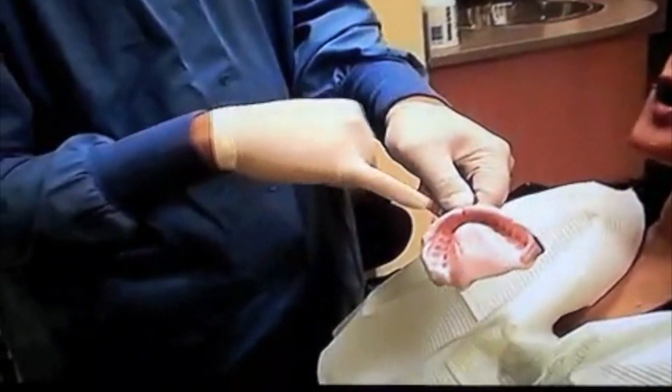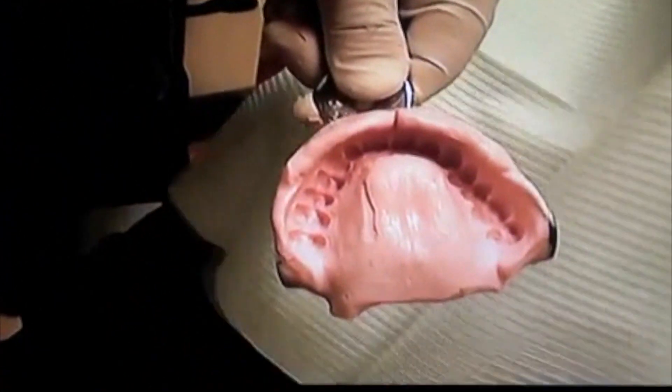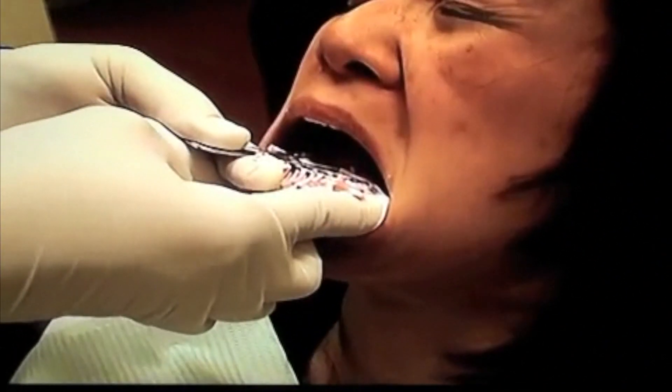What you're trying to look for is to make sure that you've got the front up and all your teeth. Start from the back first, then pull it up.